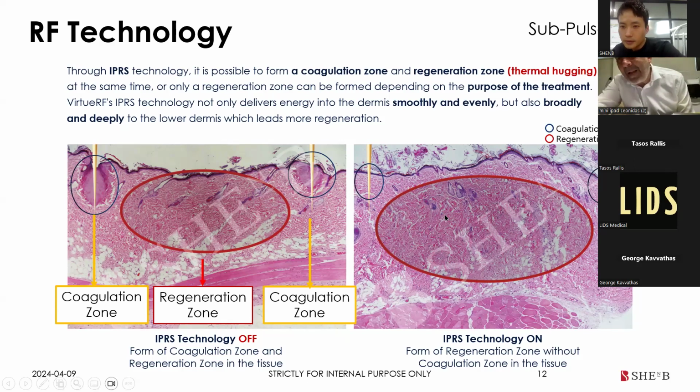So that means we can say, according to our privileged knowledge with the Vivace, that the blue tip, we usually use it with the micropulse technology. Yes, because usually this is the tip that is recommended for skin tightening, etc. Correct. And the red tip, usually we use it in one shot with one pulse. Correct. But it's not always like that.